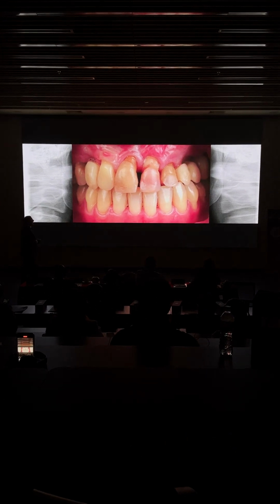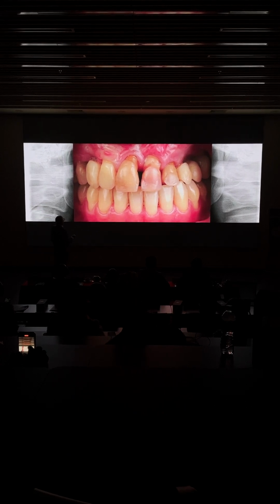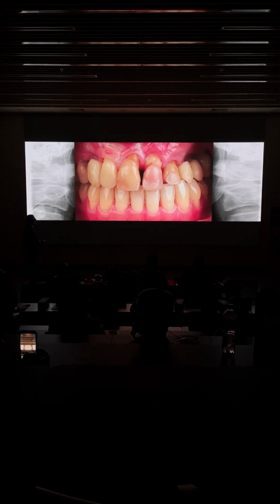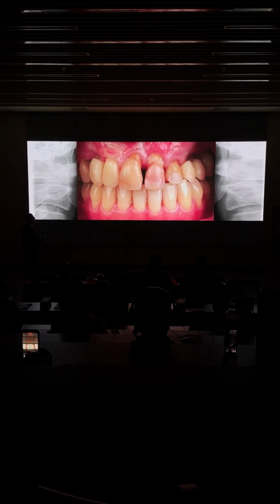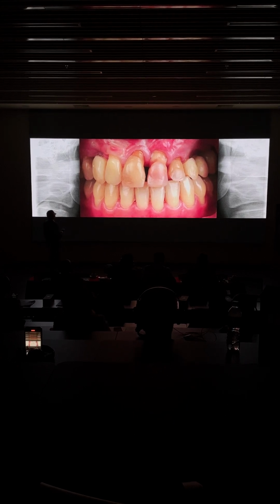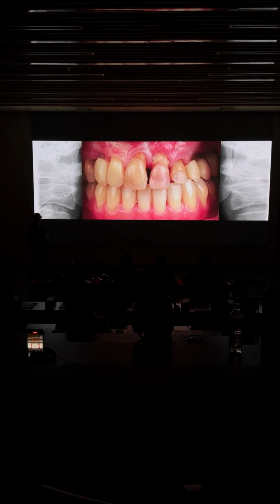So this is the hot potato I have to fix. You can see that I have a lot of scars, no keratinized mucosa, and an overclosed vertical dimension. This is a canine. This is the first bicuspid. This is the first implant. There are 3 implants in a row here. This is a lateral incisor. This is a canine. This is an implant that is 8 millimeters palatally. It's touching the root, which is resorbing here. So I'm losing this tooth.